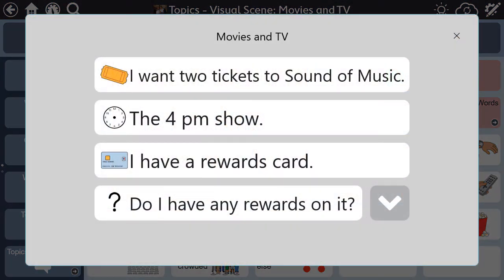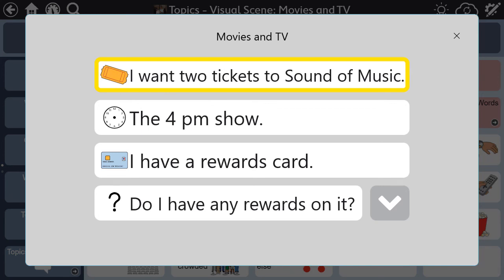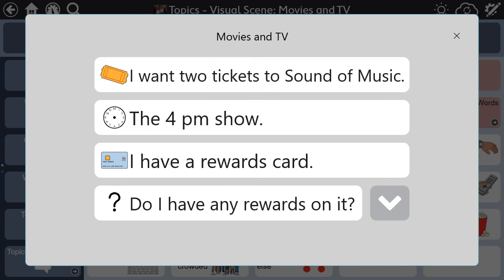The person with aphasia can select each line of the script to listen and then practice as many times as they want, even right before buying their movie ticket. Or, the person could also choose to use the script to speak the message for them during the interaction. Either way, the person with aphasia can successfully buy tickets for the movie that they want to see.